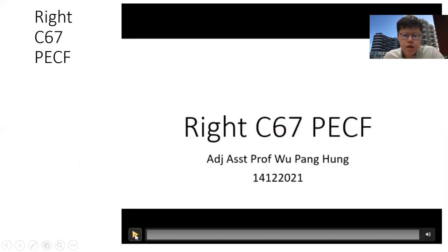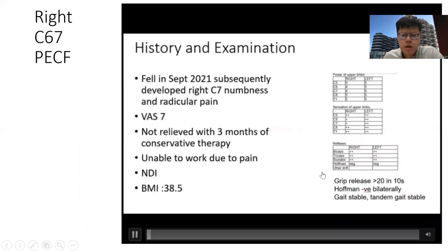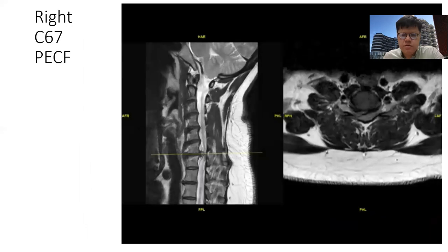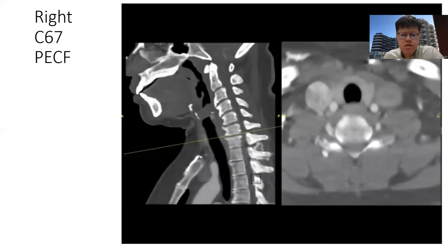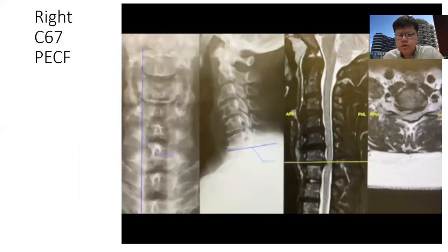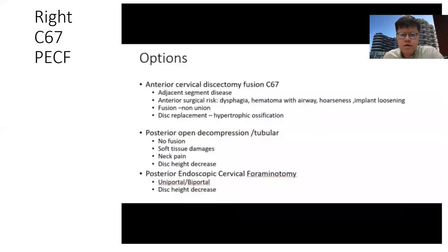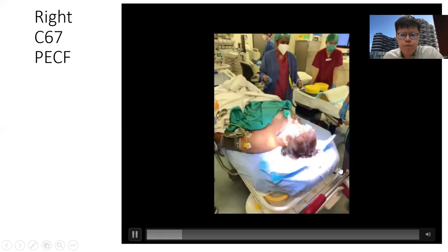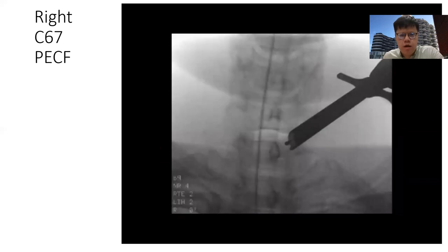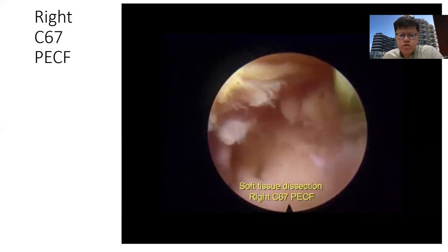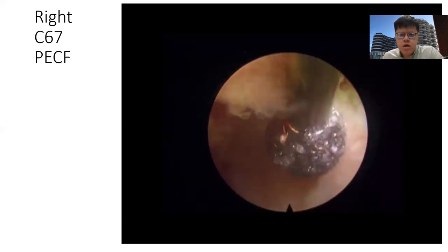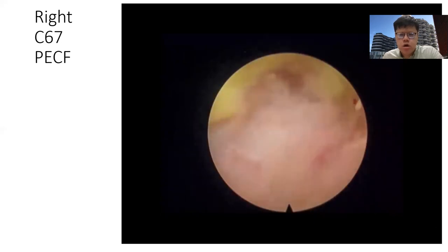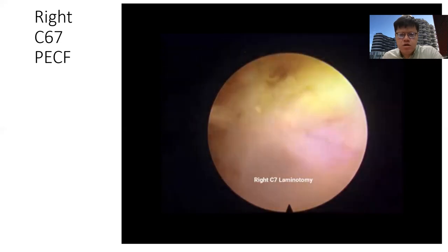This is a video showing how we perform right C6-7 PECF. This patient fell last September and subsequently had unrelenting right-sided radicular pain and weakness at C6-7. We can see there is a soft disc prolapse at right C6-7. She met the indication for ACDF, tubular open, or endoscopic foraminotomy — the choice was endoscopic foraminotomy. We perform soft tissue dissection, exposing the V-point, which is essentially the lateral mass of C6-7, on the right side endoscopic.